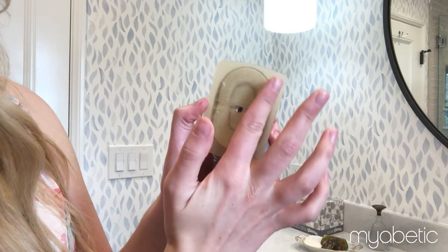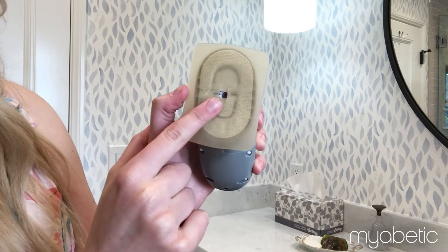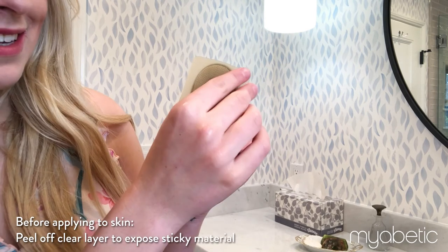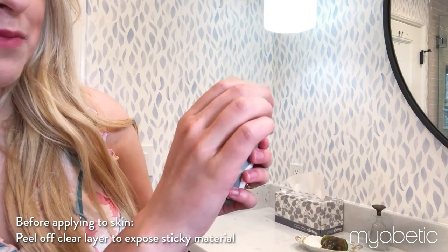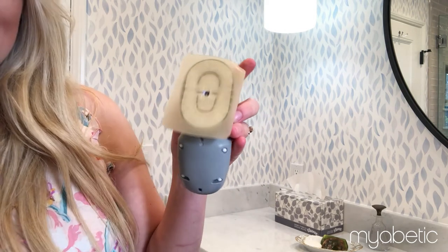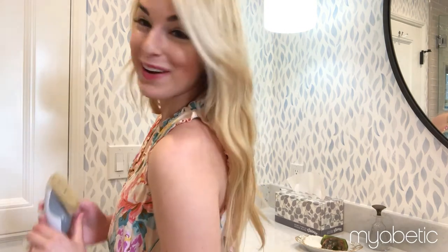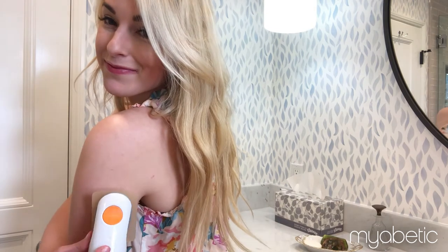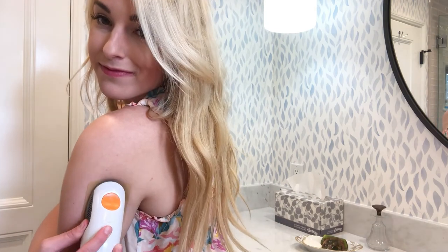So now we know that the center is right there in our pre-cut hole. Now we'll remove this backing as our final step before we put the hydrocolloid gel and the sensor on our skin. Okay, it's time to put our sensor on. Now you can just put your sensor on like normal.